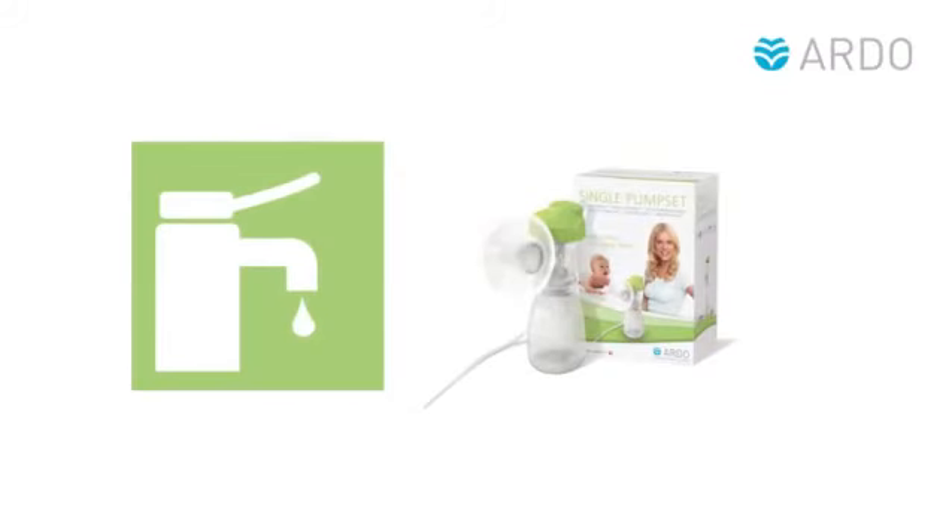Disassembling and Cleaning the Ardo Pump Set. Wash the pump set thoroughly before using it for the first time and after each further use.